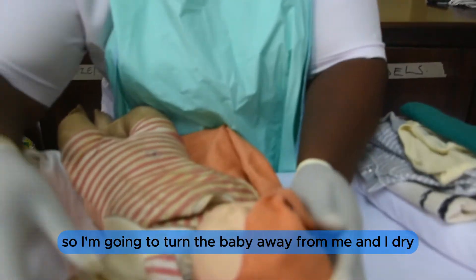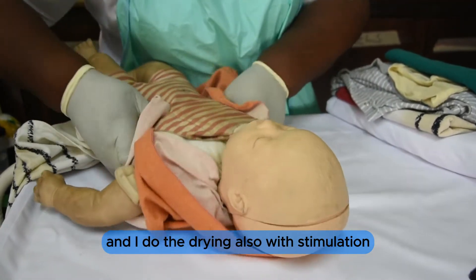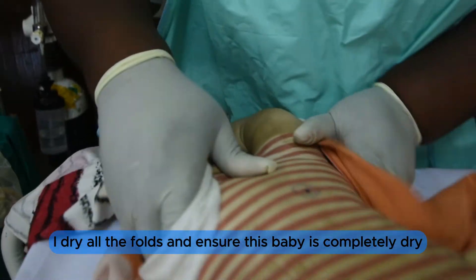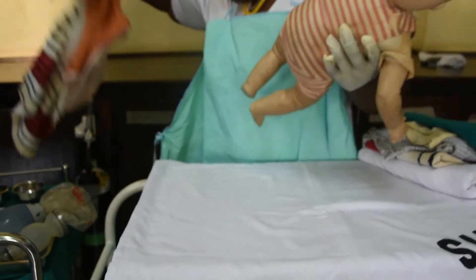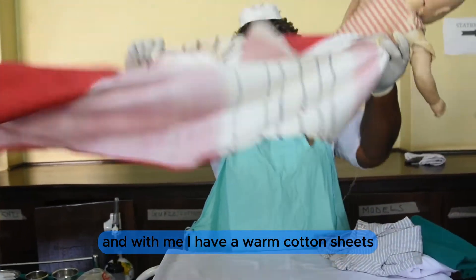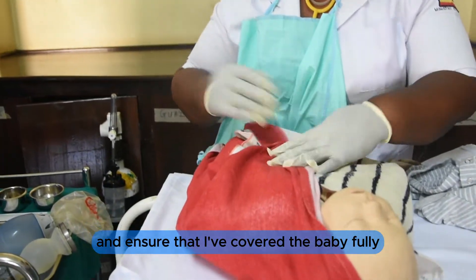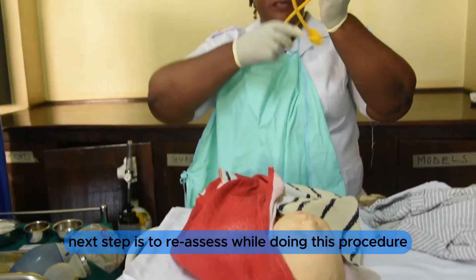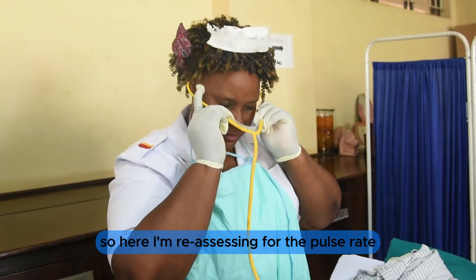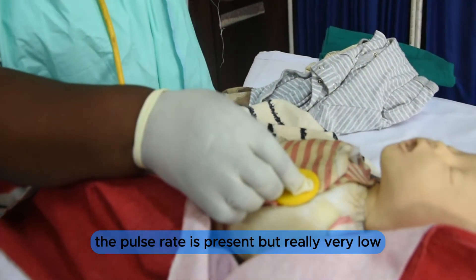I turn the baby away from me and dry with stimulation, drying all the folds and ensuring this baby is completely dry. The wet sheet is now discarded at the bottom of my tray, and I replace the baby in warm cotton sheets, covering the baby fully. The next step is to continually reassess. Here, I am reassessing for the pulse rate. The pulse rate is present but very low.